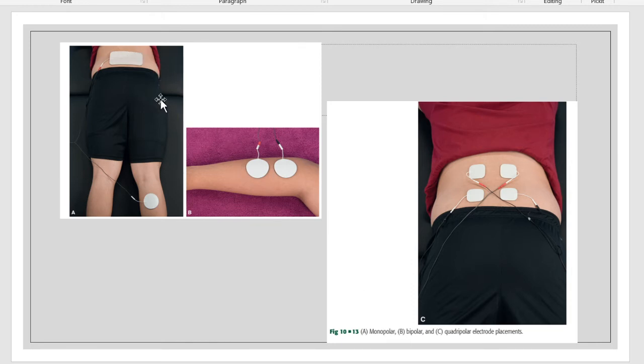When you stimulate with monopolar, one electrode is placed on the back, and the other electrode is not in the region. This is usually used in treating wounds, for healing, and the penetration is greater. Here you have the dispersive, and this is your active electrode. The current is released very condensed and focused, so probably the wound is here.